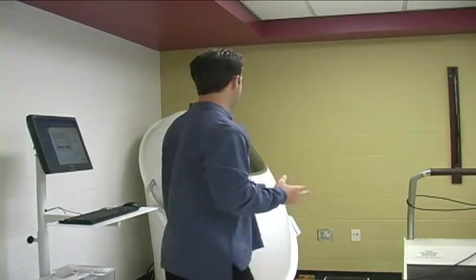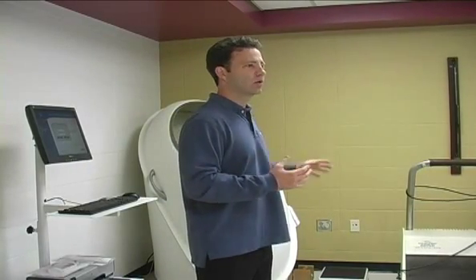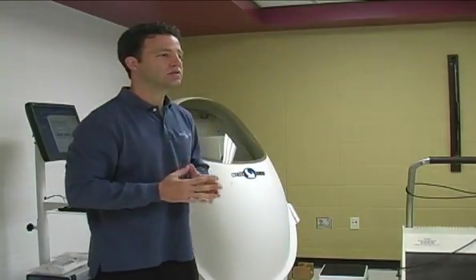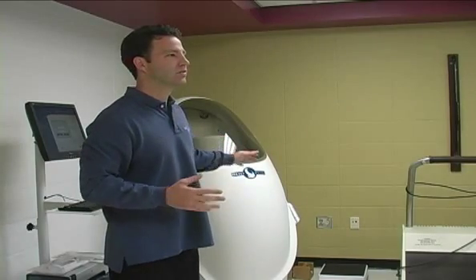hydrostatic weighing. The other thing, it's totally non-invasive. So anyone can be assessed in it, whether they're in a certain disease state, even if they claim to be claustrophobic, and I'll go into that a little later, that some of the other modalities, DEXA, has radiation. So there are no contraindications, which is nice.